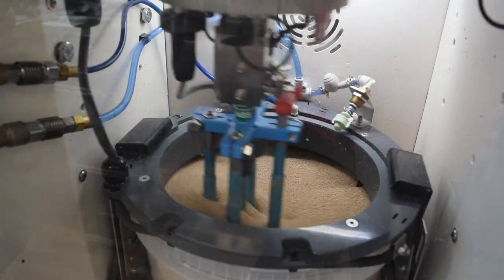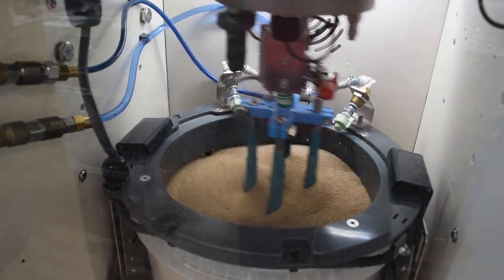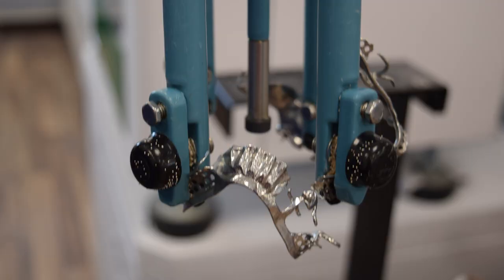This innovative technique runs an electrical current through a medium that forces our metal framework to oxidize. As small burrs and microscopic irregularities oxidize, they are simply buffed away by the medium.